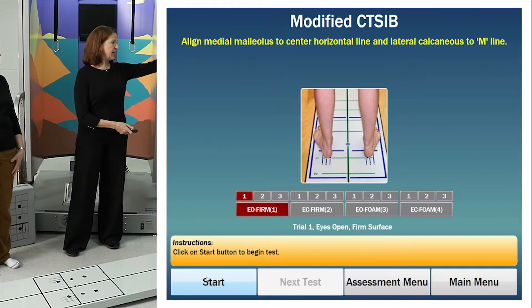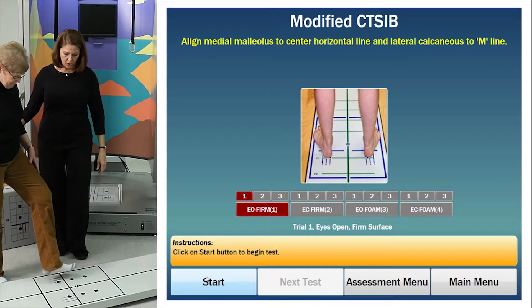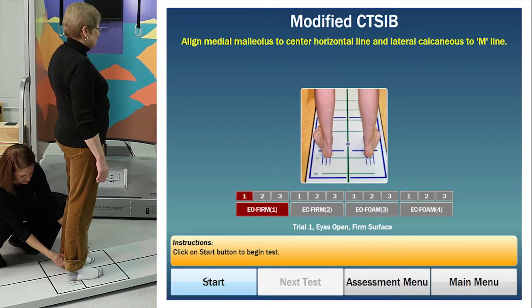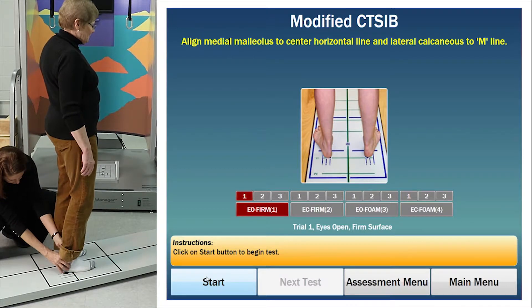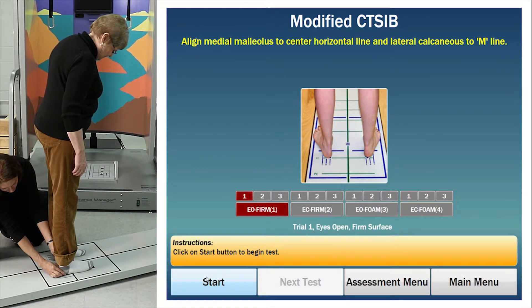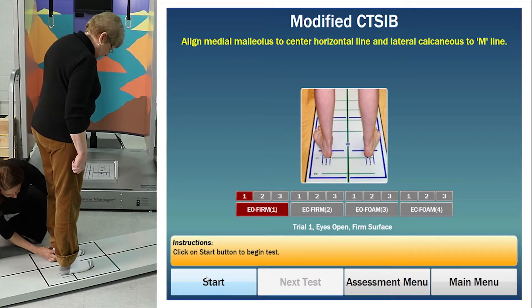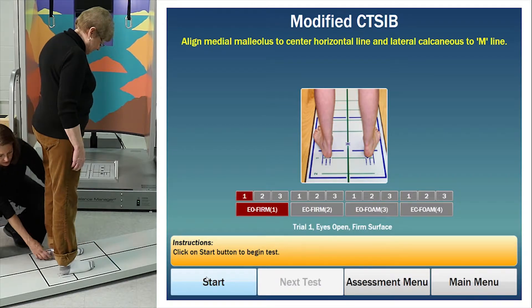Click on continue and we are going to get her set up on the force plate. Climb up here and put the arch of your feet over those circles. I'm going to roll up your pant legs just a little bit — I need to see your ankle to set it up properly. Put that medial ankle bone along that black line and the lateral outside of your ankle on the M line. Scoot this foot out a little bit and forward, and toes look pretty good.